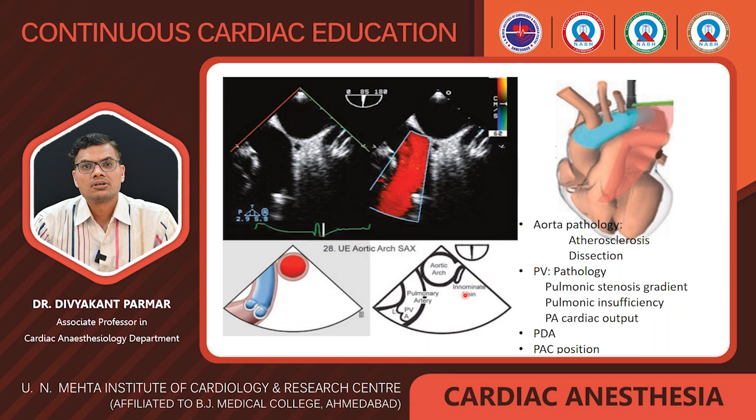If we slightly withdraw and rotate the probe from right to left side, then we can also see this common carotid and the brachiocephalic artery. We can also see whether any PDA is present or not.